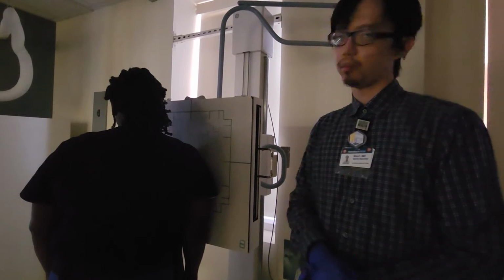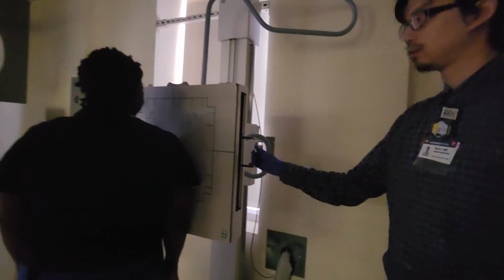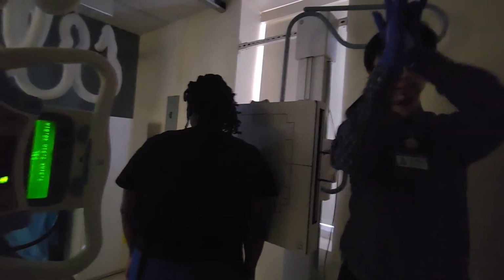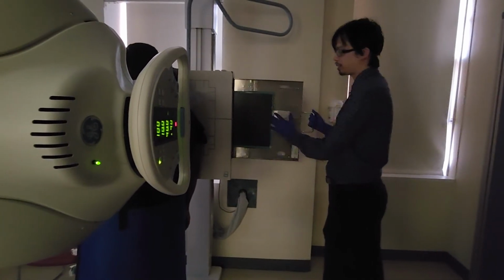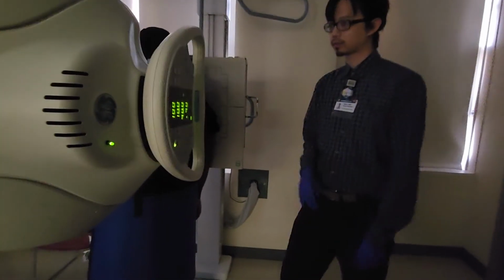Next up, my obliquity. And this is the part, oh, I'm sorry, I almost forgot. When I do the Y, the Y looks like this. Where's the long part of the shoulder now? Down, like this, right? What do you notice here? The set is still crosswise. So let's switch this lengthwise first. So pop this to 12, pop this to 12. So long now, right? But this better fits that Y of the shoulder.